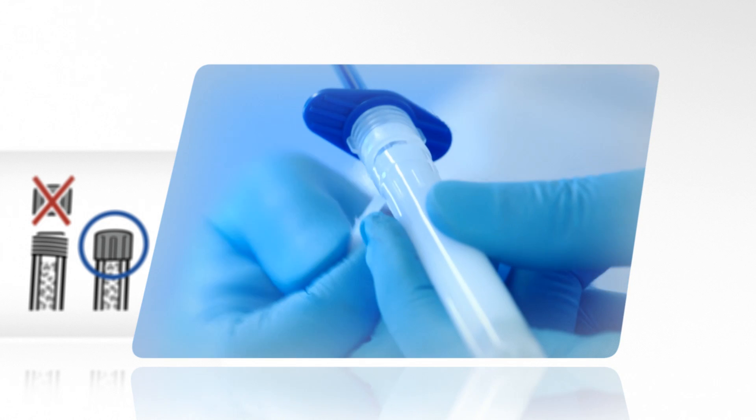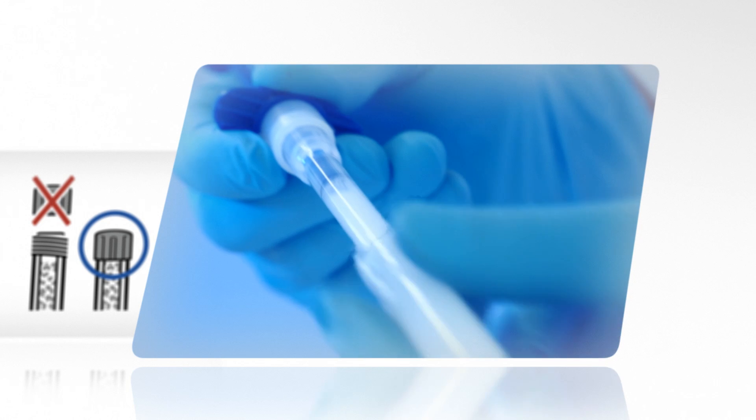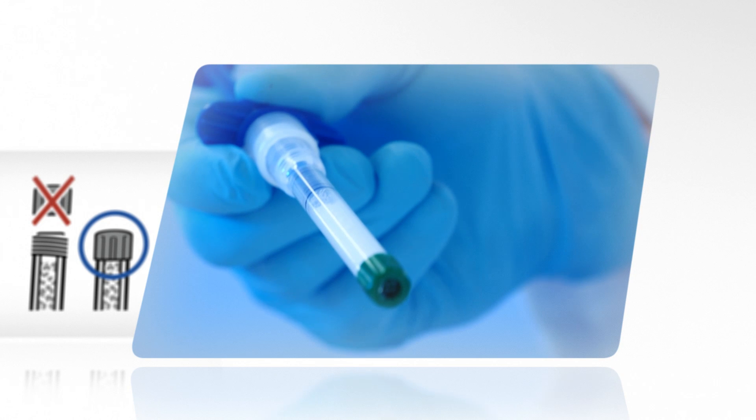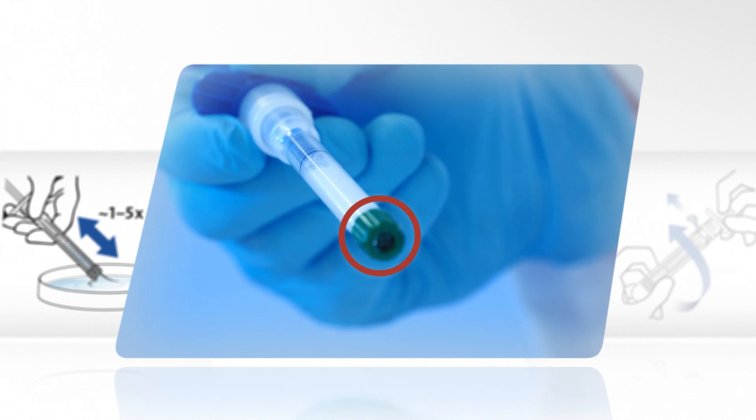Tear off the protective seal and unscrew the protection cap. This exposes the applicator and filter cap. Do not remove the filter cap from the applicator at this step.